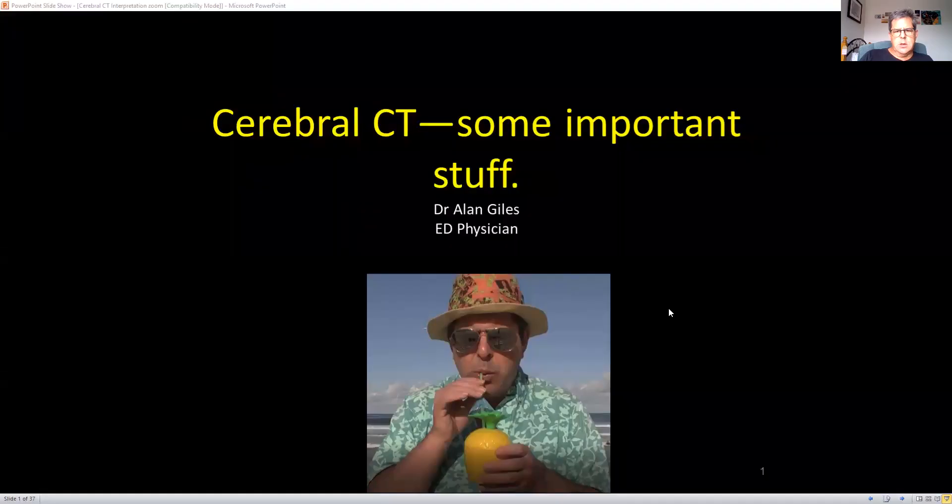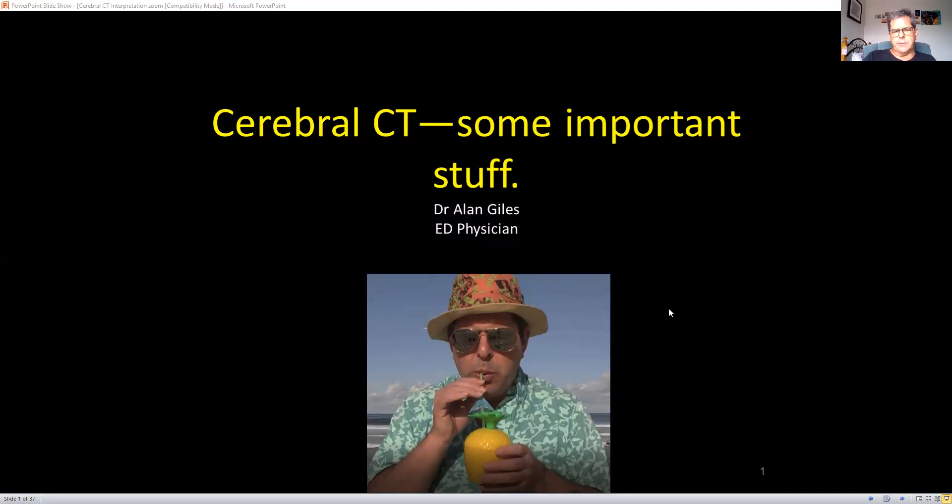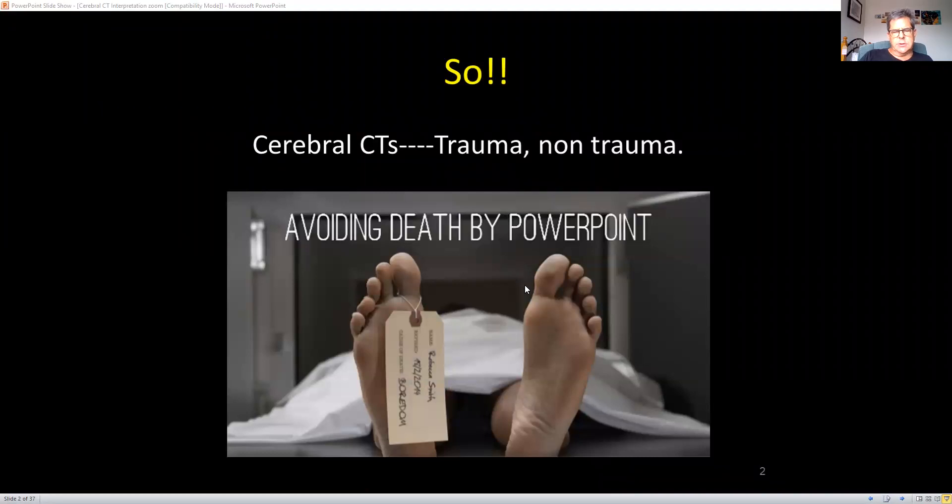Welcome. I thought we might have a look at interpretation of cerebral CT scans — a practical guide for the important scans, both traumatic and non-traumatic, in the emergency department. We'll do this by going through some images on a PowerPoint presentation. We're going to look at only the important stuff.